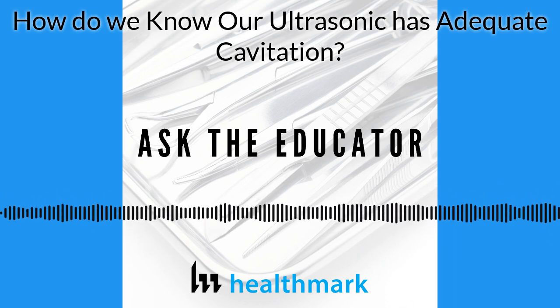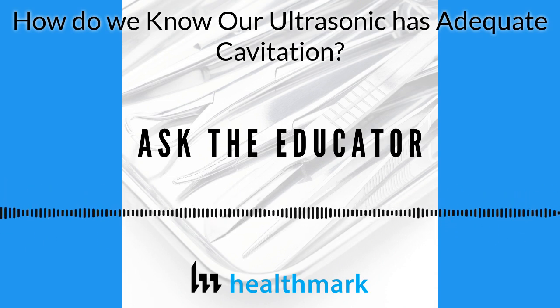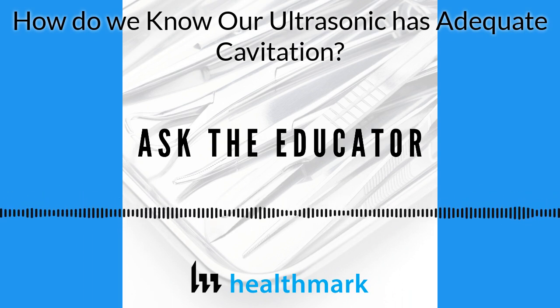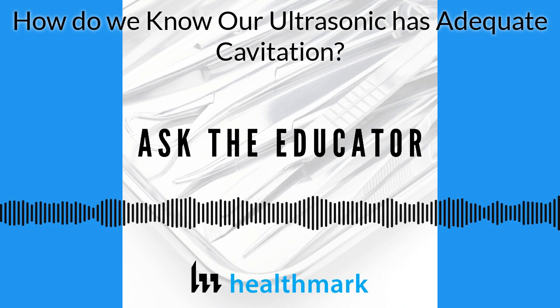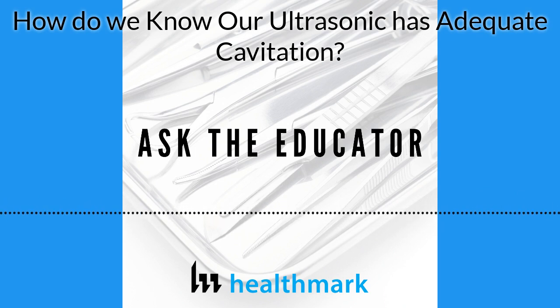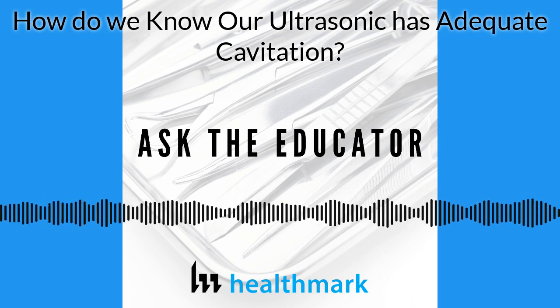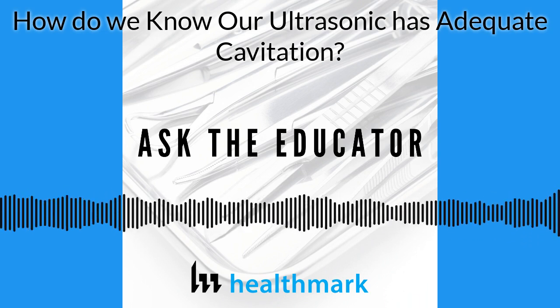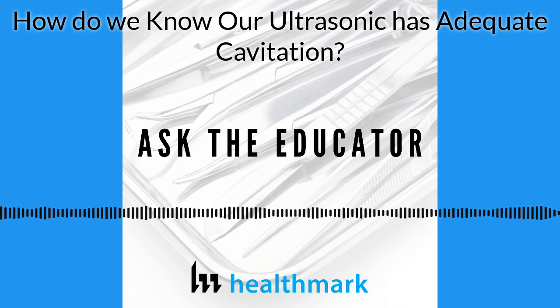Many of these, not all, but many of these have a plastic mold or block that you hook up your lumens to. That plastic absorbs and impedes the cavitation energy itself. So as you place your indicators in there, they might not change. And that is the difference, because some of these other indicators, they can come clean with just being in the presence of detergent. And they're telling you you have cavitation when you might not have sufficient cavitation. Does that make some sense to you, Kevin? And how I'm trying to put the pieces of the puzzle together?